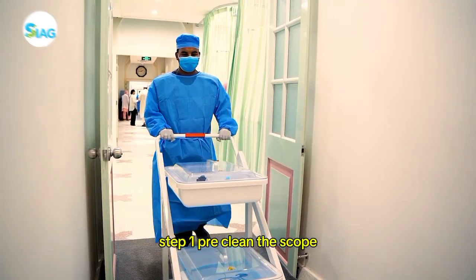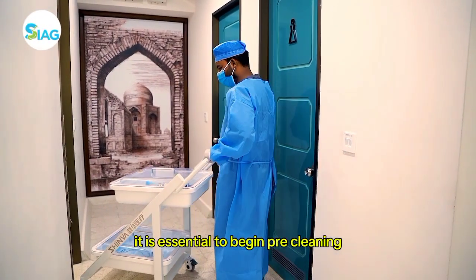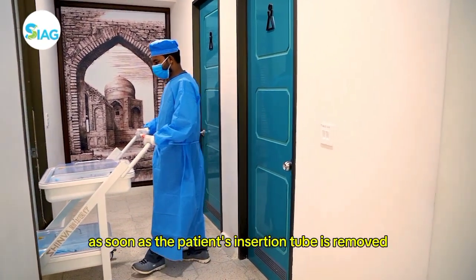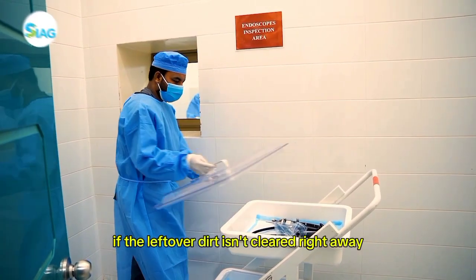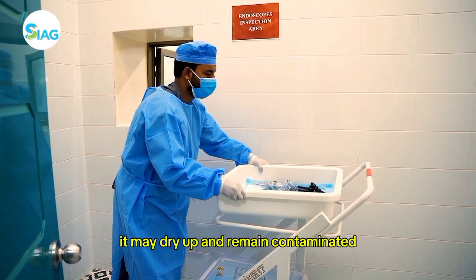Step one: pre-clean the scope. The procedural room is where the reprocessing starts. It is essential to begin pre-cleaning as soon as possible — as soon as the patient's insertion tube is removed — since this helps to stop any biofilm from forming. If the leftover dirt isn't cleared right away, it may dry up and remain contaminated.